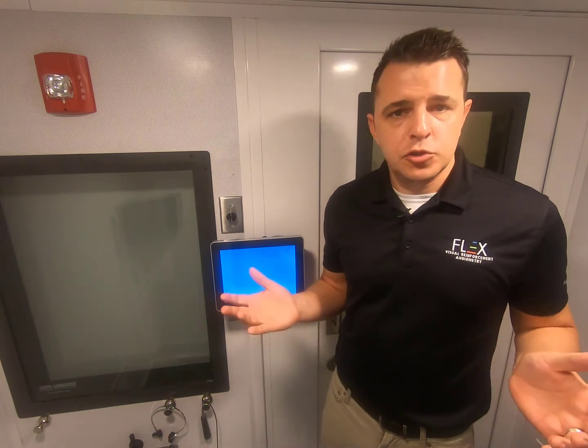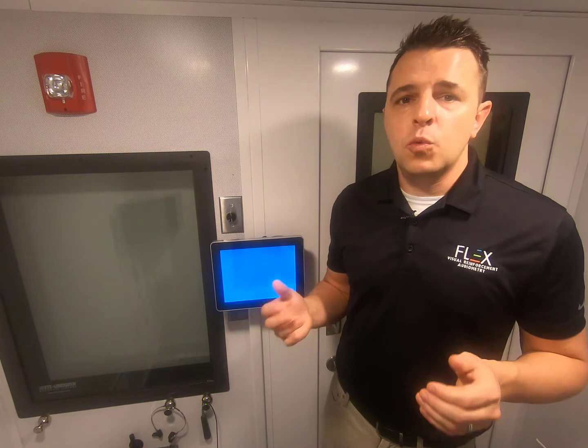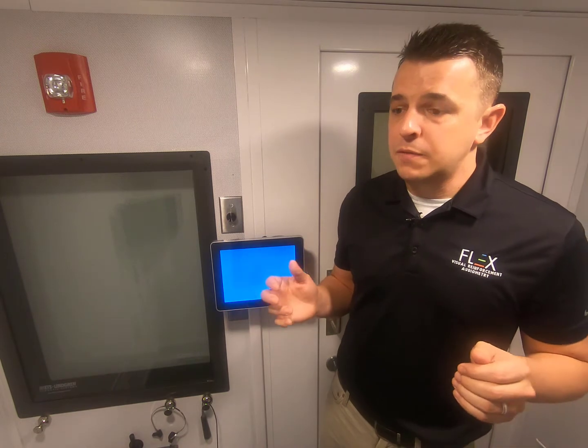If you did have a larger booth or a high pediatric population, you would definitely want to opt for the full-featured Flex VRA, as those larger monitors and multiple stimulus types will be very helpful when testing pediatric patients.